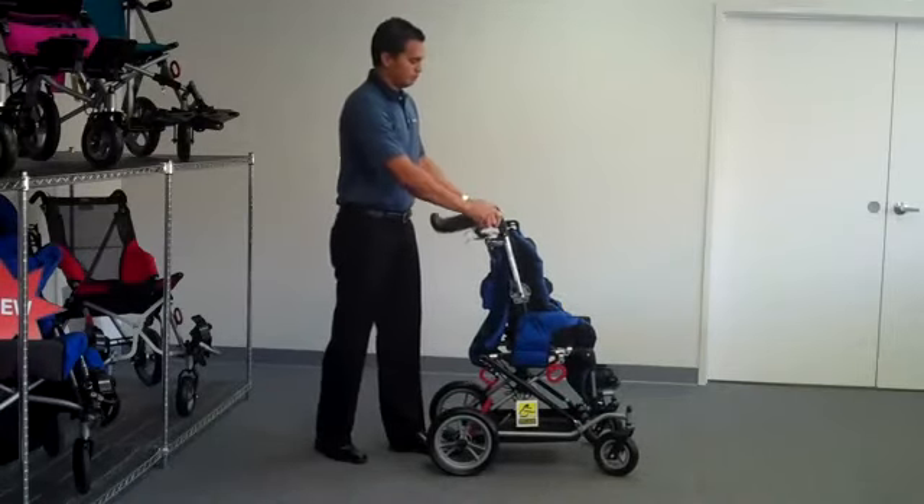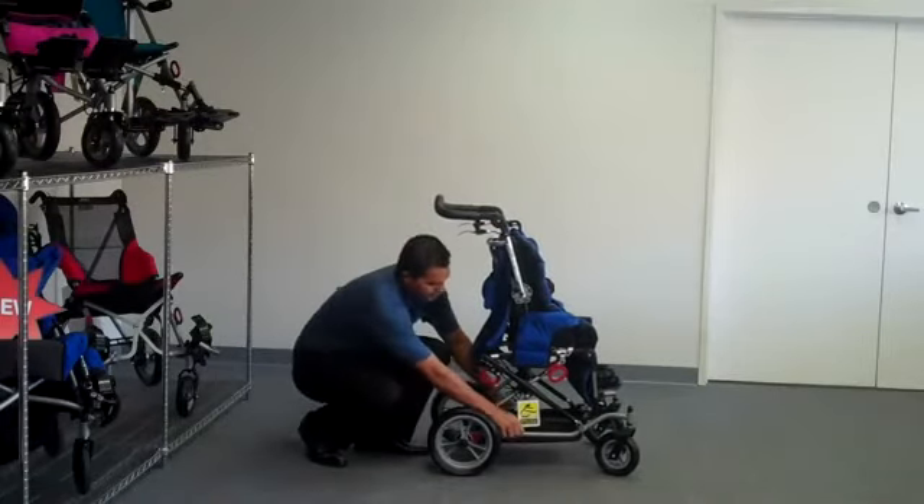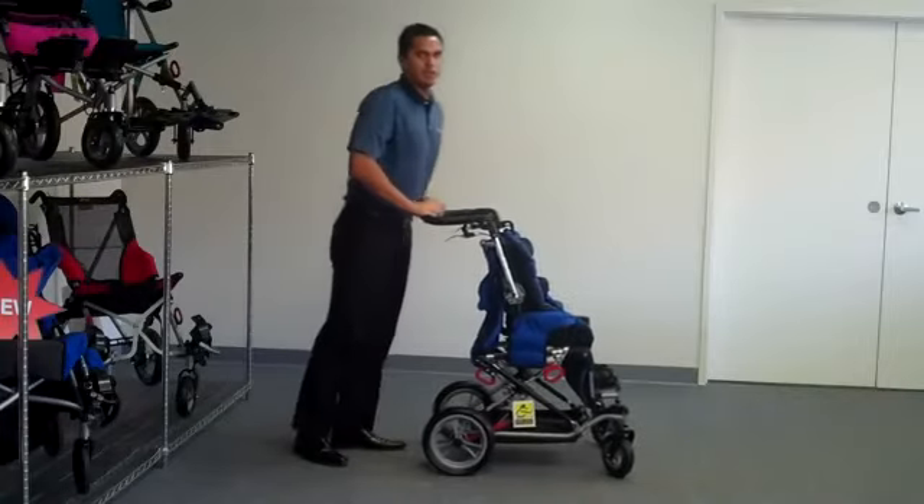Get your push handles back in position, operate your gray push handles, disengage your brakes, and you're on your way.